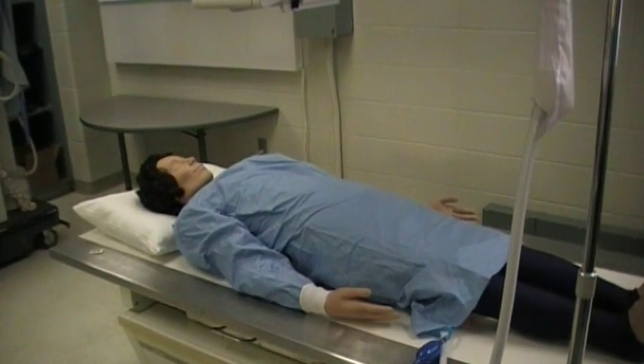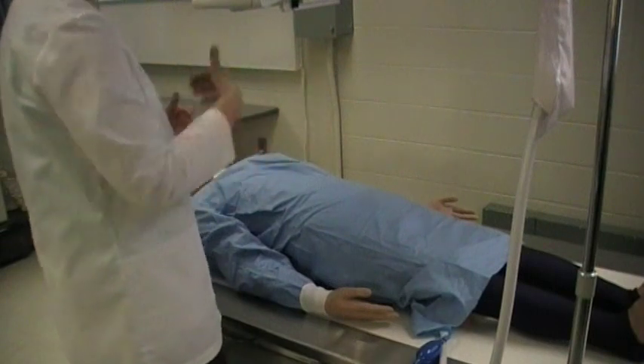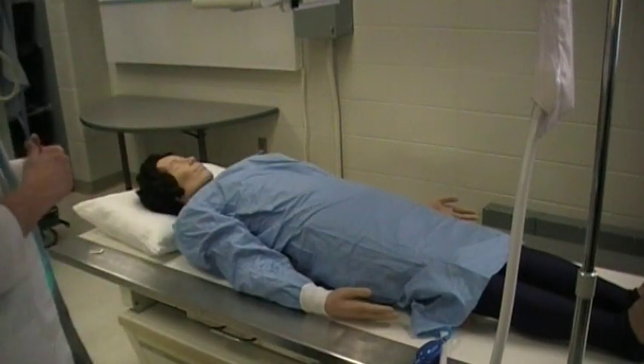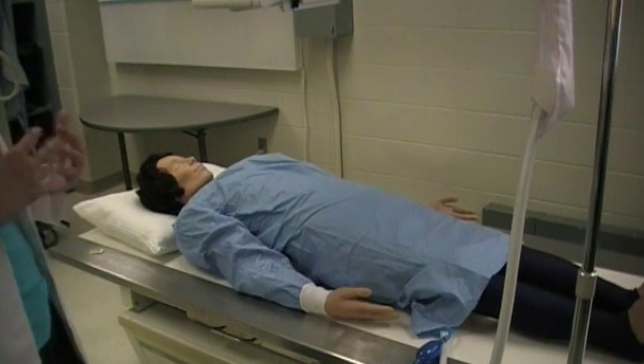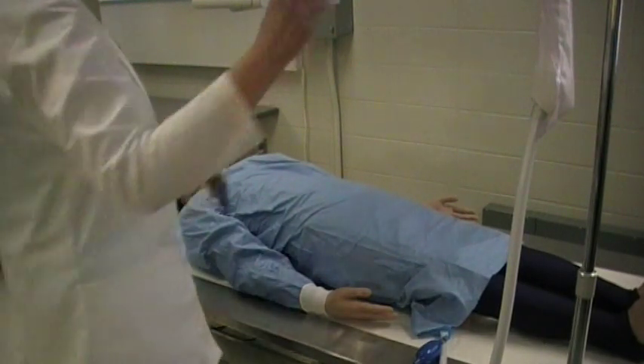I'm going to demonstrate the patient positioning for the barium enema, following a typical protocol for the air contrast BE. Once the doctor has left the table, have the patient turn over to the stomach, back to the back, turning a couple of times to get the air and barium mixed well, coating the walls of the colon.